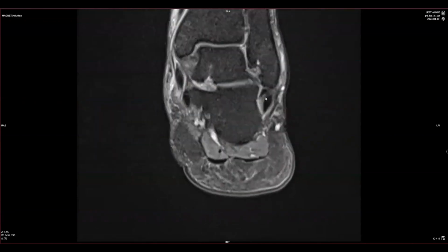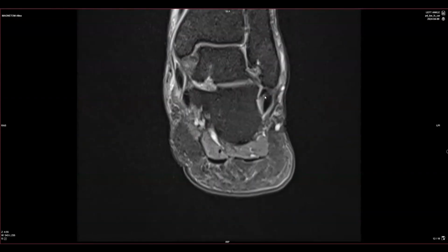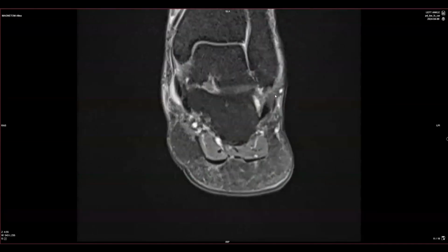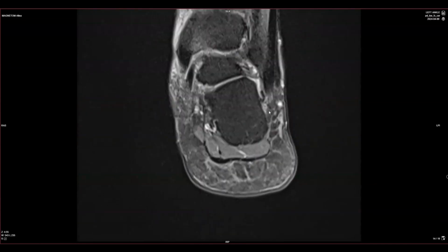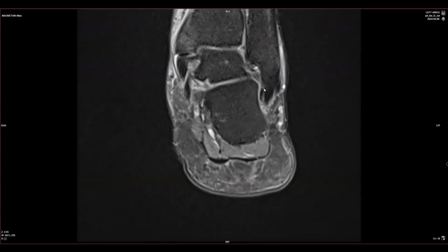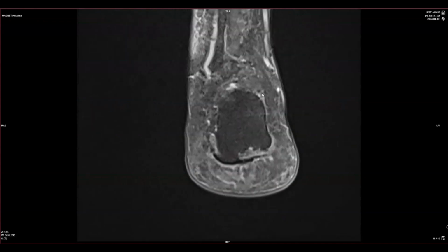I feel that I'm still practicing in different ways, but at least I now can identify that there is this lateral talocalcaneal ligament. Now, the calcaneofibular ligament, I'm seeing some part of it here to here to here, and that's the calcaneofibular ligament. So the talocalcaneal ligament is this structure here that moves posteriorly, and then I think it might be that superior band here.